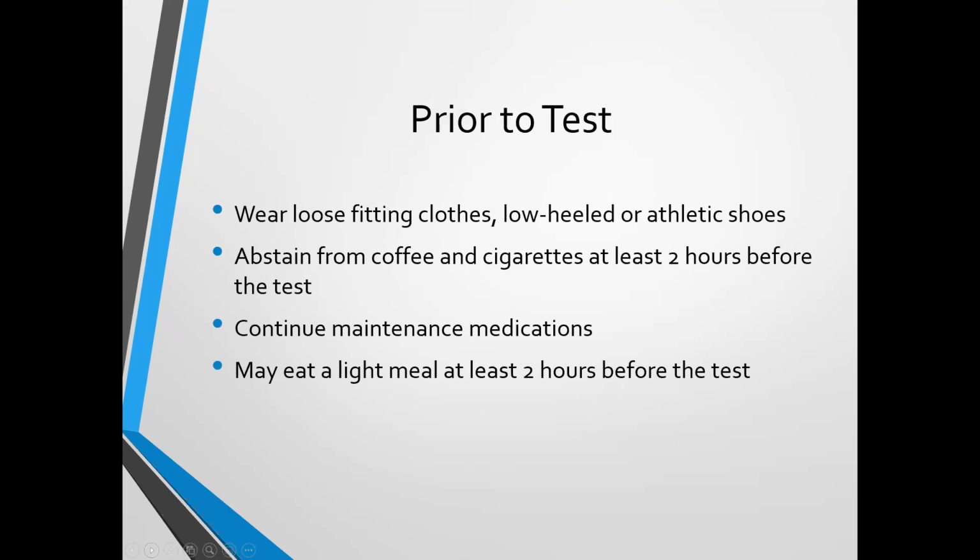Prior to the test, there are things an individual would do almost as if they're going to perform any rigorous exercise. Loose fitting clothes, comfortable shoes, abstain from coffee, cigarettes. Again, they're making some allowance there. They're not encouraging people to be active smokers, but they're also recognizing that may have actually put them here. And if this helps screen them, and they're trying to quit but not quite there yet, we maybe shouldn't delay the exercise stress test because they're still actively smoking, particularly if they're really working the program and have cut down a lot, whatever.